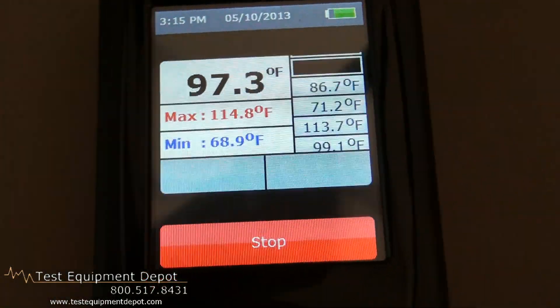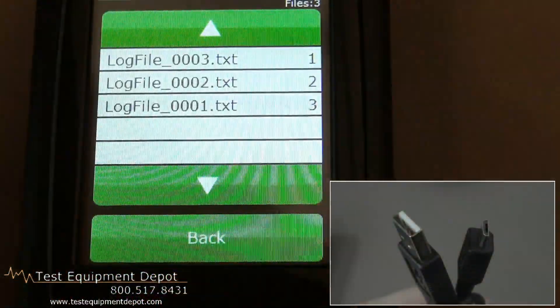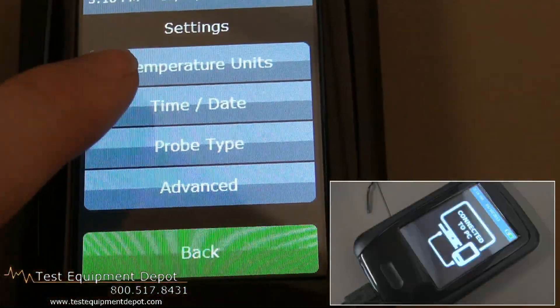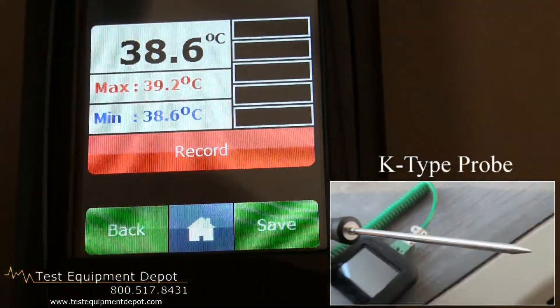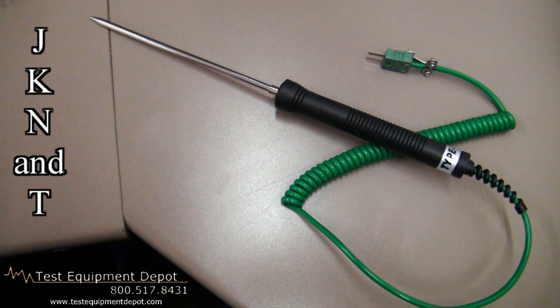It has an internal rechargeable battery. Its saved data is downloadable by USB, and it is supplied with a K-type probe. It's also compatible with J, K, N, and T thermocouples.